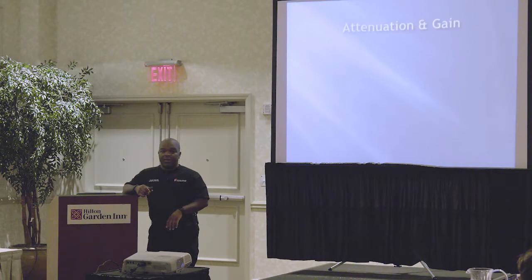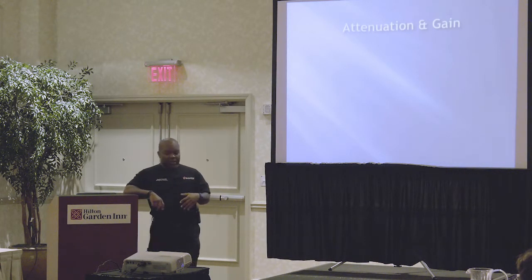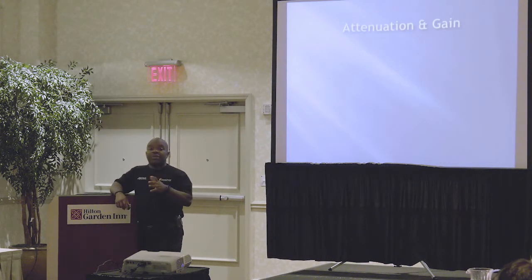You're not allowed to change the power anymore. But you can change the gain and you can fix the attenuation. What exactly is the gain? Well, it's just like turning up the volume of a stereo, all right?